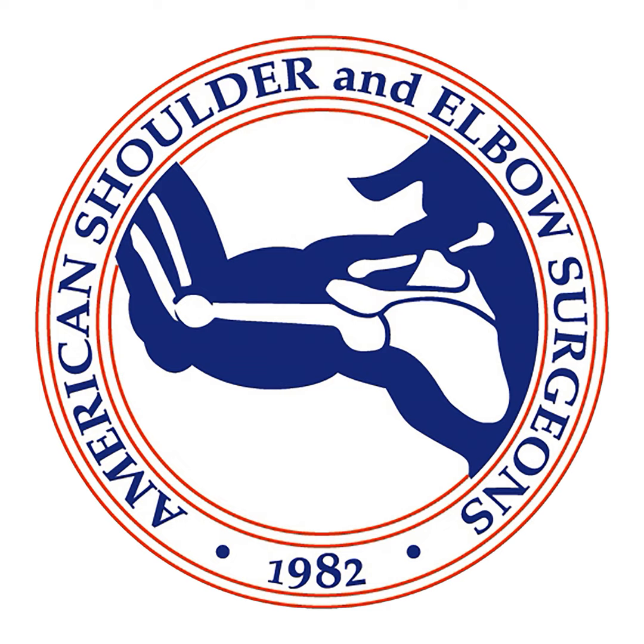I don't typically use patches as first line unless there's really severe tendinopathy. I call them tendinopaths, where the tendon is really of poor quality. But it would be extremely rare in a first primary case for me to use a patch. There might be a rare instance where I would use an augment, but it would be extremely unlikely.